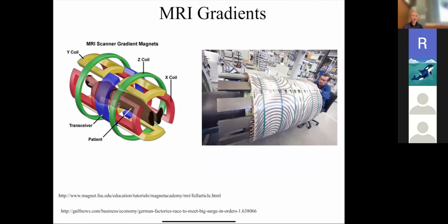Okay, so that's the RF coils. We'll get back to that. Now, the next coil we want to talk about is the gradient coils. For the most standard magnets, there's going to be three sets of these: an X gradient, a Y gradient, and a Z gradient. Their job is to create a gradient in either the X direction, the Y direction, or the Z direction. We'll talk about why we need to do that later, but for now, I'm just giving an overview of what the coils are there for. This, I believe, is from the Siemens factory floor, an example of the intricate coil designs that they use to introduce these gradients in the field.